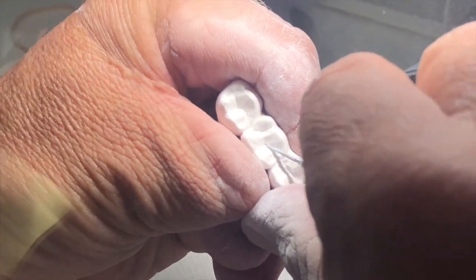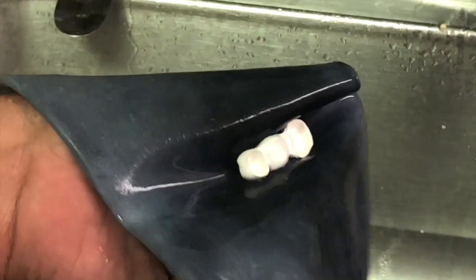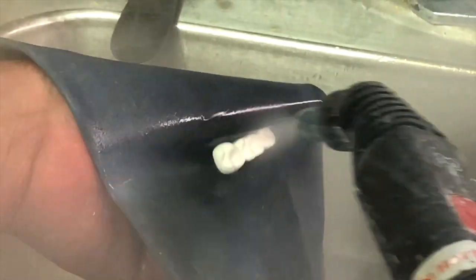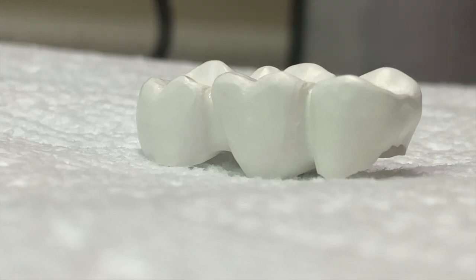Then I will take it over to my steam cleaner and steam clean the intaglio surface, occlusal surface, and all of the axial walls. Make sure all of the zirconia dust is off of it. I'll let it sit on a paper towel for about five minutes before it goes into the sintering oven. I hope you enjoyed this second tip.